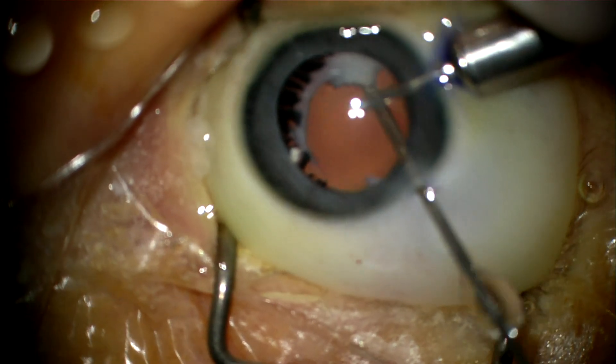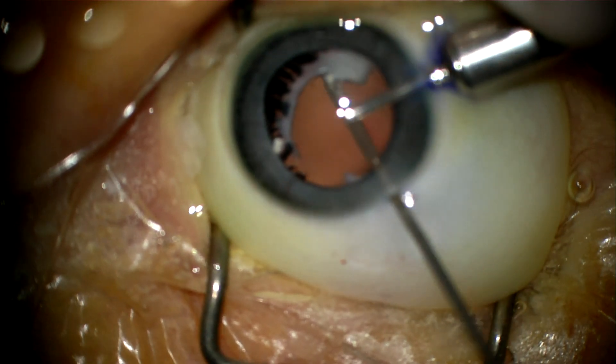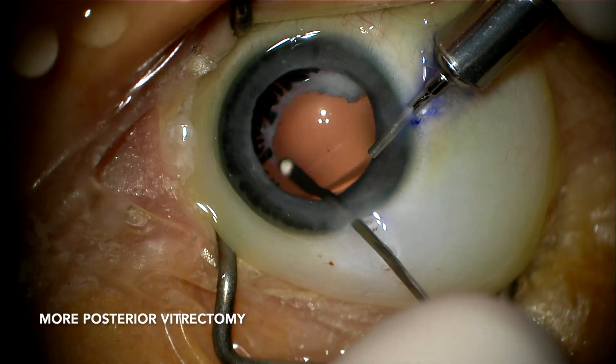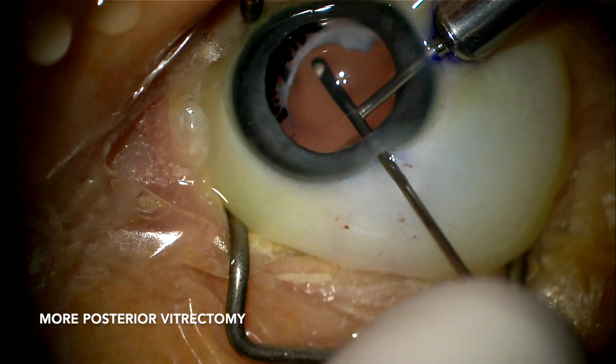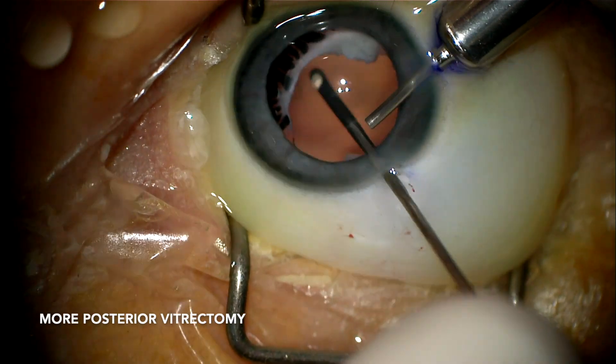The visual axis is cleared. The retina is inspected and is normal. Further posterior vitrectomy is performed.